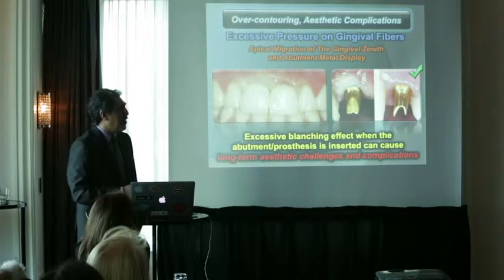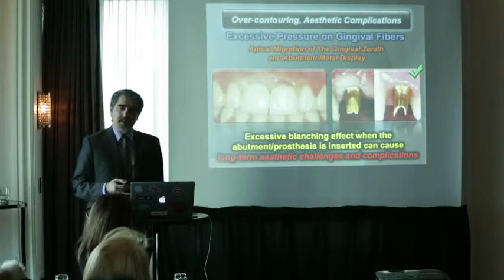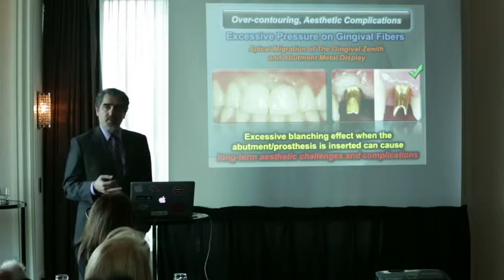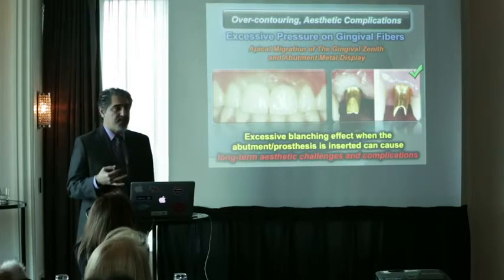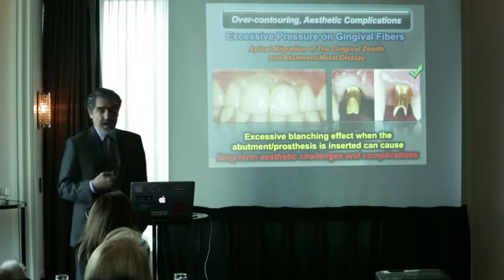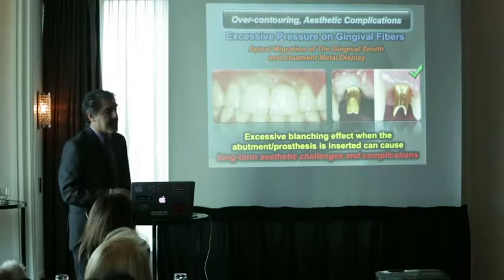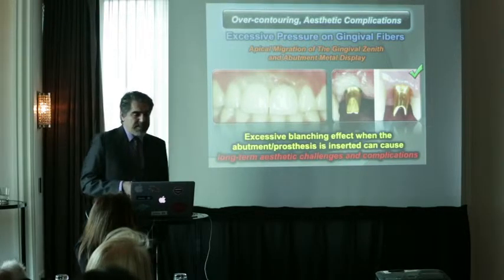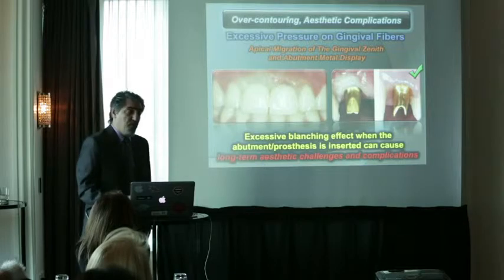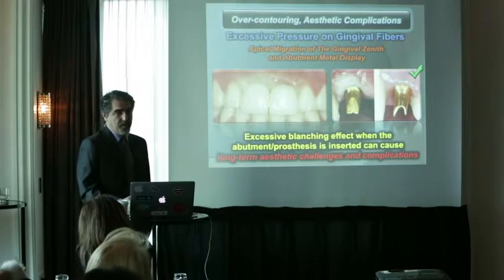Mostly because when you have so much pressure, the soft tissue may react differently. There will be some sort of changes, and the soft tissue may shrink a little bit. So in most cases, I have done that. In most cases, you get quite a bit of this kind of whitish view, and whenever you get this, you have to be very careful.